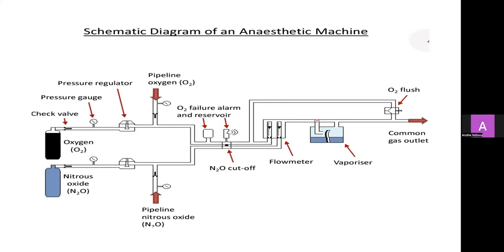Which type of cylinders do they use for manifold? I think the J cylinder. Sorry? I didn't get that. Is it not J cylinders, Dr. Suba? Yeah, it's the bigger ones. To be quite honest, I always mix them up. If it's not J, it's H cylinder. Yeah, it could be J, actually. J, yeah, it's J, I think. Well done. Okay, thanks.